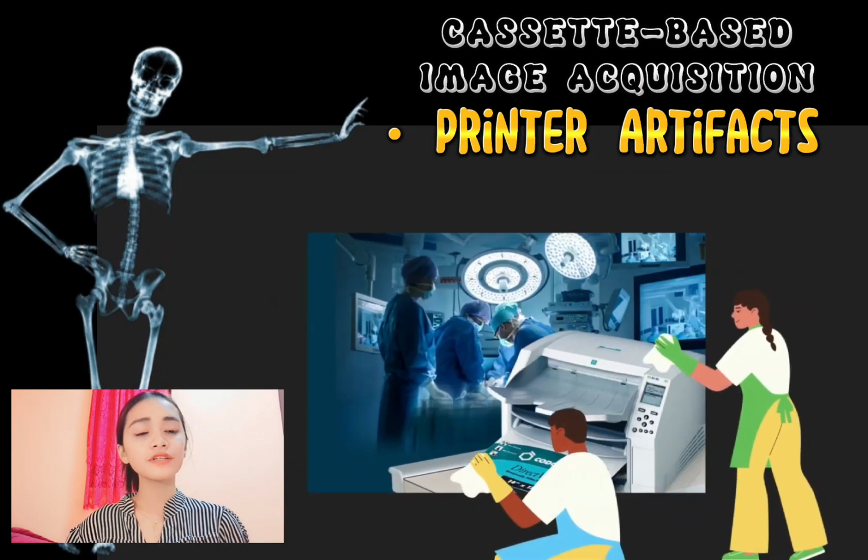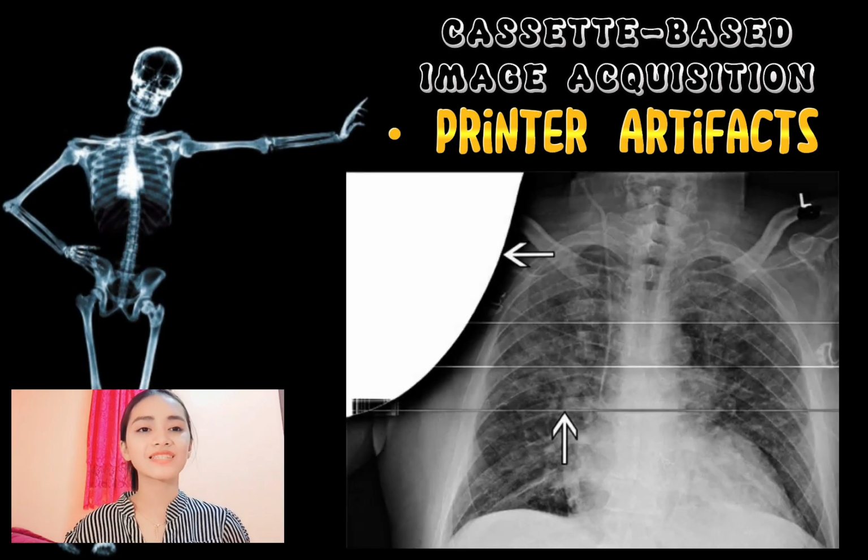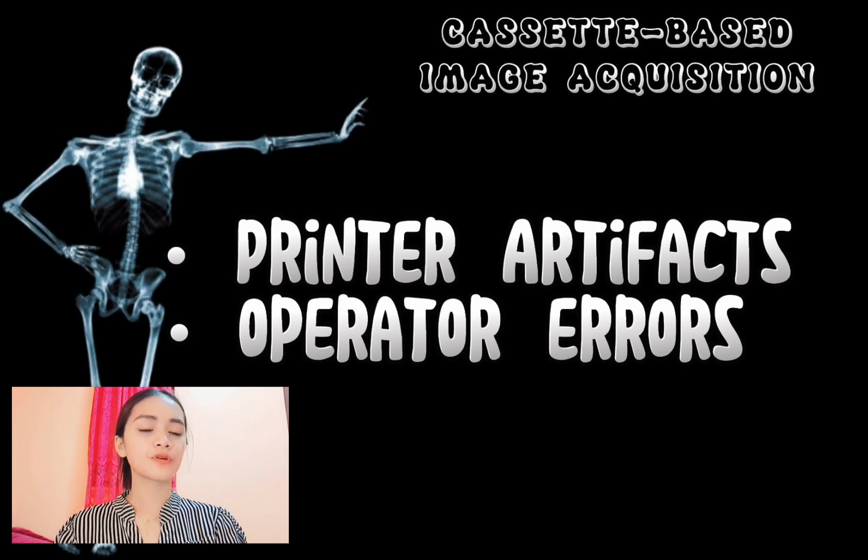So, service personnel will need to clean the printer to avoid poor equipment performance that results in poor image quality and may lead to repeat imaging and therefore increase radiation exposure and cost. And now let's proceed to operator errors.